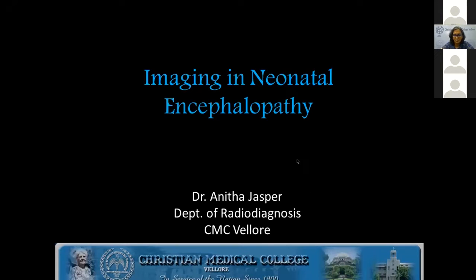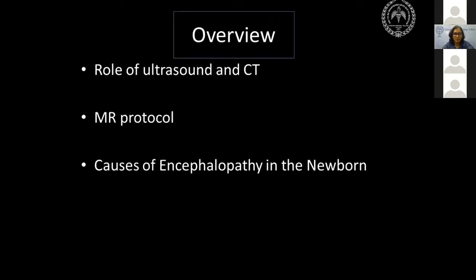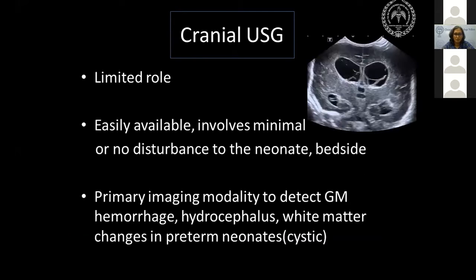I'll just start my talk on the neuroimaging findings in neonatal encephalopathy. This is a very vast topic, but I shall try to condense it and bring out some of the salient points in this next half an hour. This is just a brief overview of what I'm going to cover: what is the role of ultrasound and CT, the basic MR protocol that needs to be followed, and then the imaging findings in various causes of encephalopathy in the newborn.